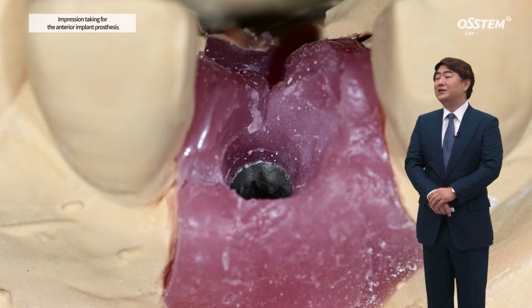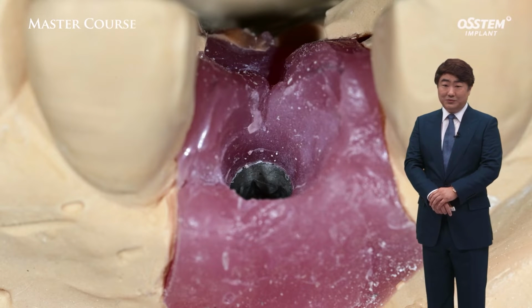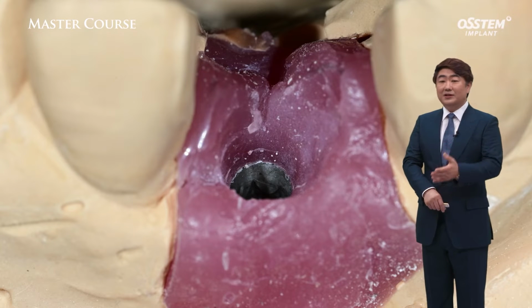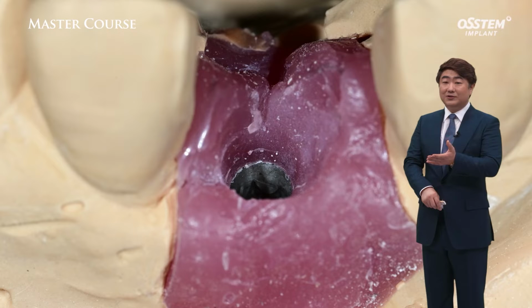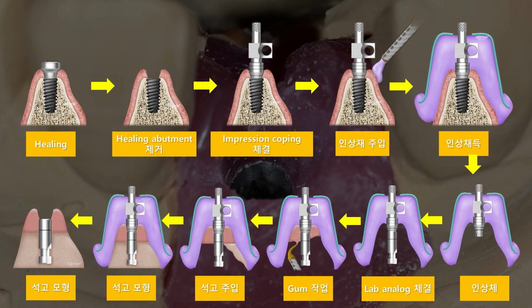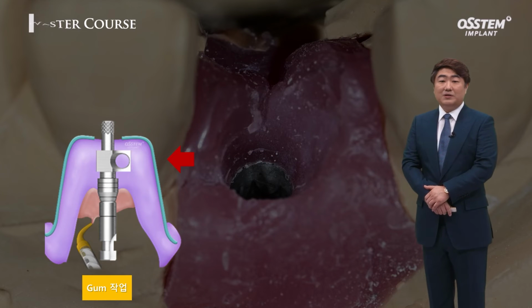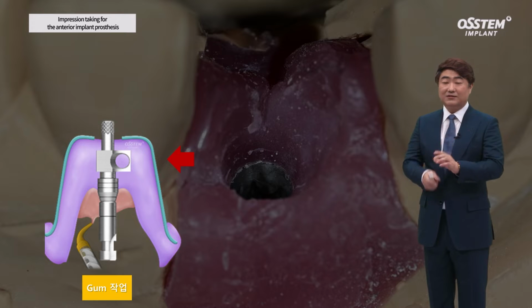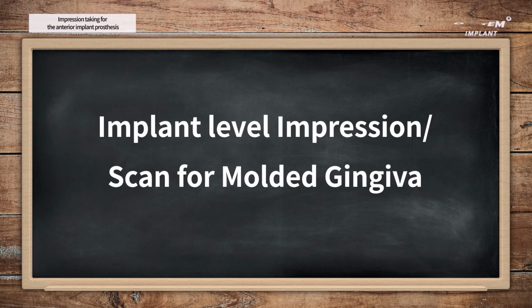Hence, to include the running room, rather than at the abutment level, an impression at the implant level is necessary. In this model, if you see the running room area, there is a horizontal line, and that is the impression coping line. If you use an impression coping, the running room created by pouring it in the model is its external shape. Of course, that can change depending on the size of the coping.